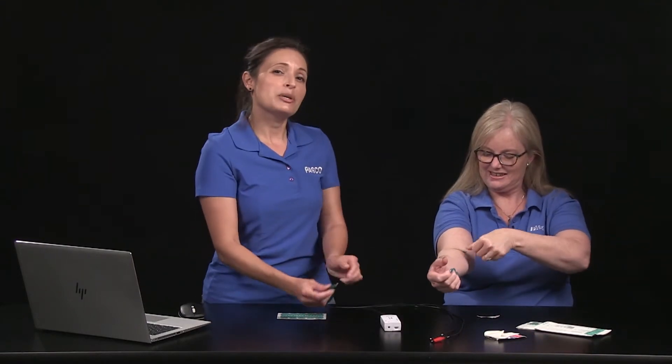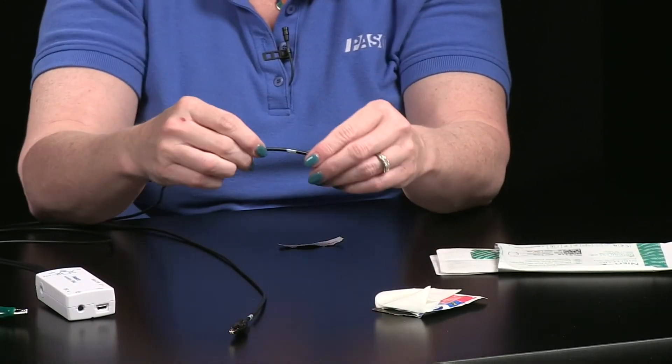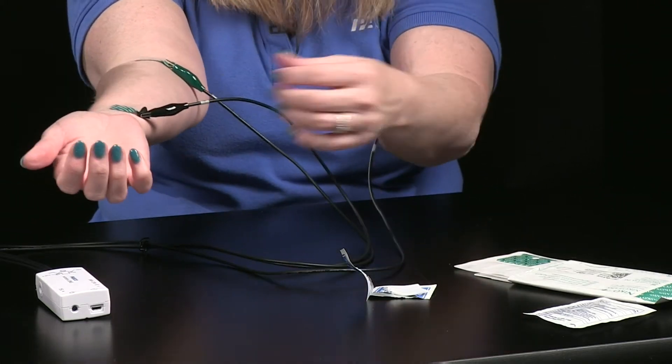One patch is placed at the left forearm just below the elbow. Another patch is placed just below the elbow on the right forearm, and another at the right wrist. If necessary, pull the plastic alligator clip cover back to fully expose the grip area. Clip the red electrode marked positive to the electrode patch on the left side. Clip the black ground electrode marked R to the right wrist patch, and clip the green electrode marked negative to the right forearm patch.